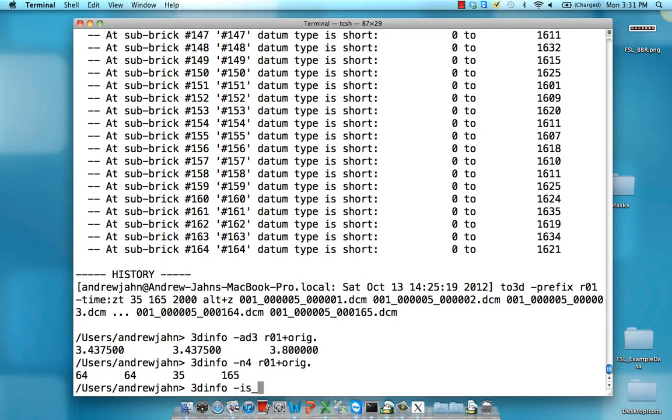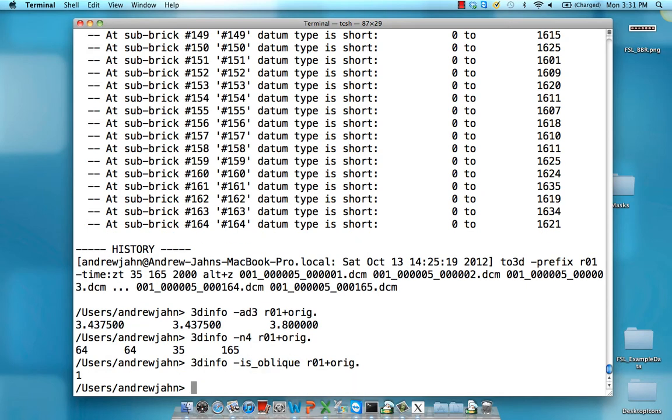You can also find information such as whether the dataset is oblique or not. 1 means that yes, it is. 0 means no, it's not.